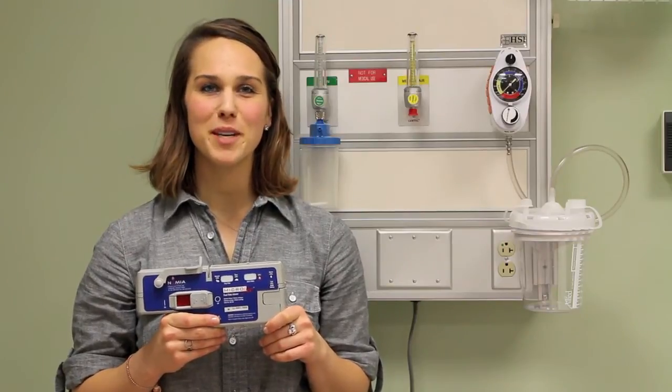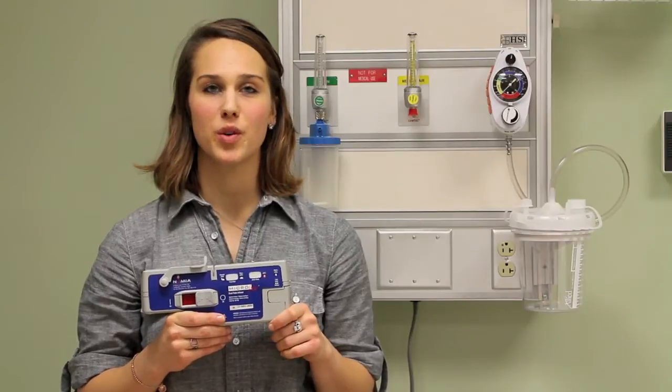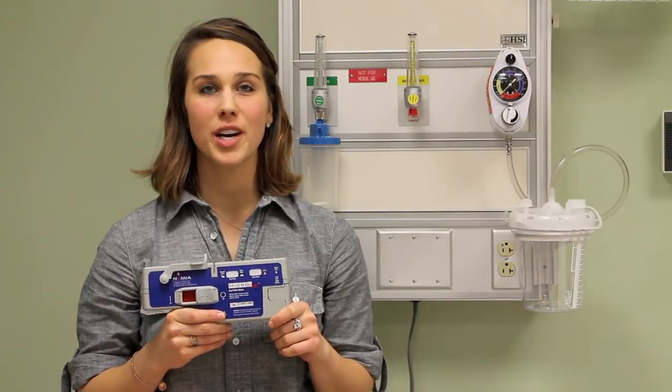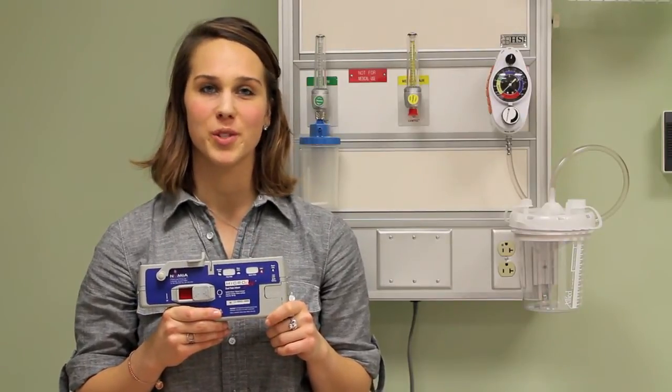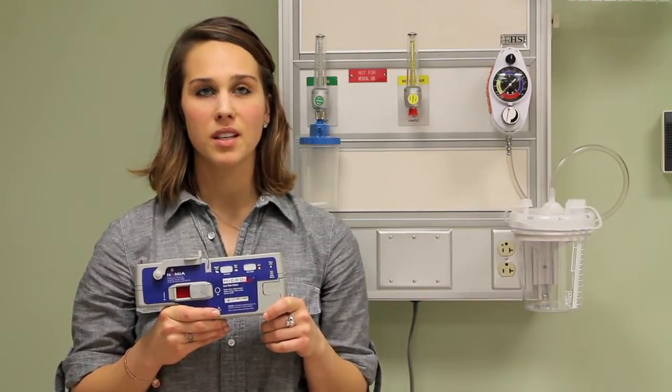Hi, welcome to Numia Medical Technology. I'm Courtney and today I will be showing you how simple it is to operate the Microfuse syringe infuser. There are three pumps in the Microfuse line: the dual rate, the rapid rate, and the extended rate. The operation is the same for all three pumps; the difference is in the rate at which they administer medications. For this demonstration I am using the dual rate pump.